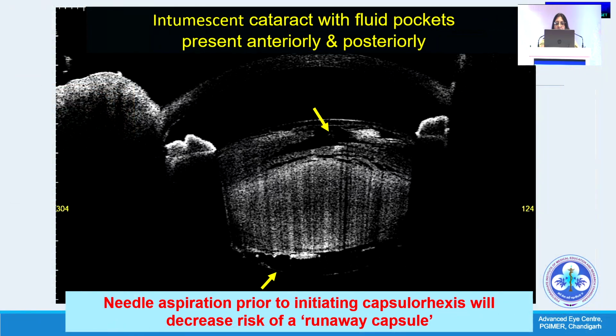On the other hand, in an intumescent cataract with fluid pockets which are present both anteriorly and posteriorly, it just makes sense to do a needle aspiration prior to initiating the capsulorhexis, which will decrease the risk of an Argentinian flag sign.